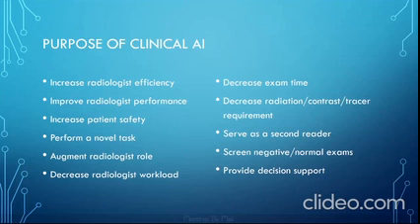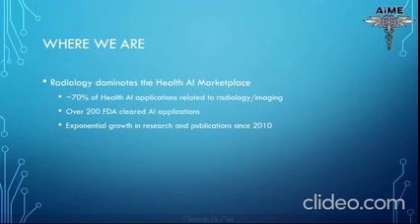The purposes listed here reflect the capabilities of AI applications that are currently available in the AI market. I'll pause here for a moment for you to read through this list. When we look at where we are now in the field of radiology and clinical AI, it becomes immediately apparent that radiology is the dominant force in the healthcare AI marketplace. Over 2/3 of healthcare AI applications are related to radiology and medical imaging, and there are over 200 FDA-cleared AI applications in radiology.